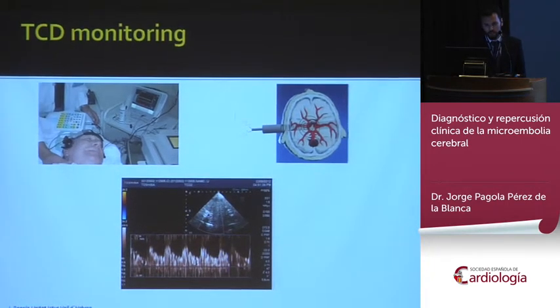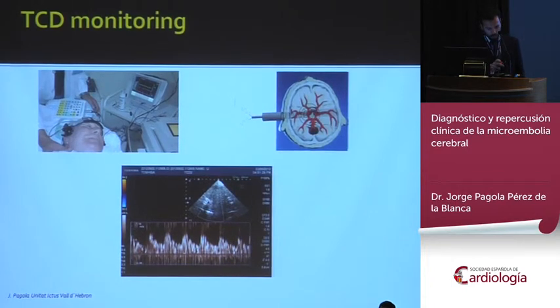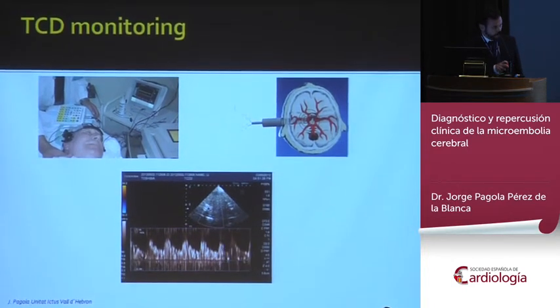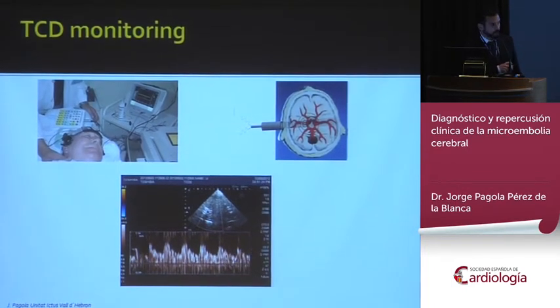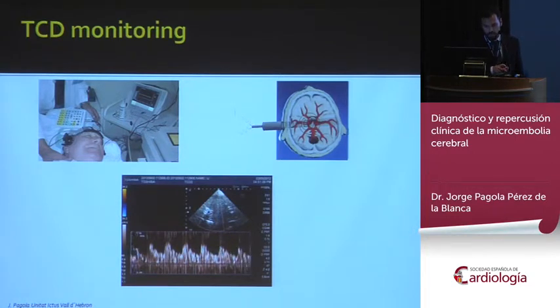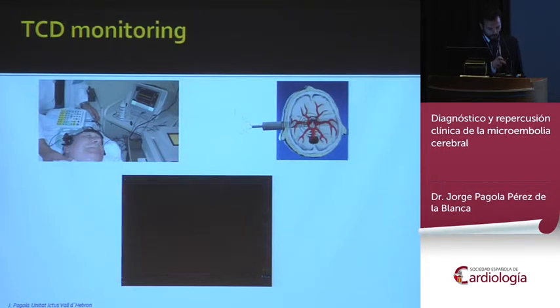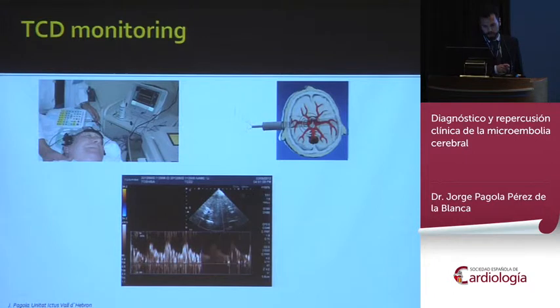This is a transcranial Doppler monitoring — it is our protocol in our unit. In the video you can see how these microsignals appear in the spectral waveform, because we just administered the contrast agent. It is an example to show what the microsignal looks like in transcranial Doppler monitoring.